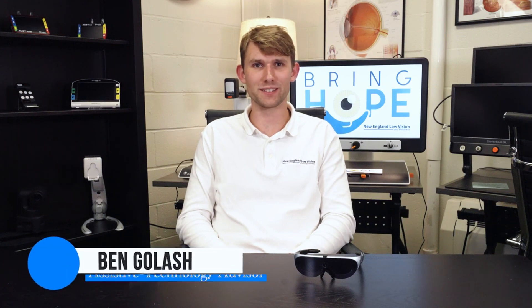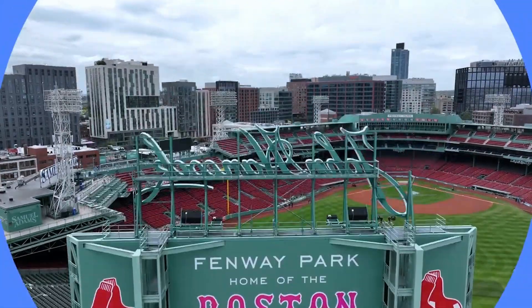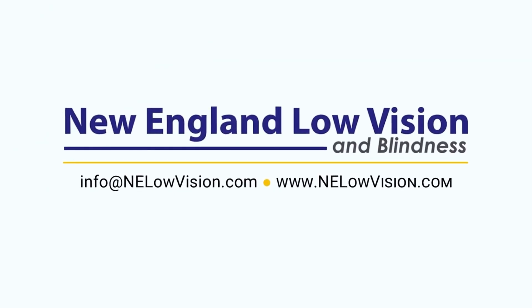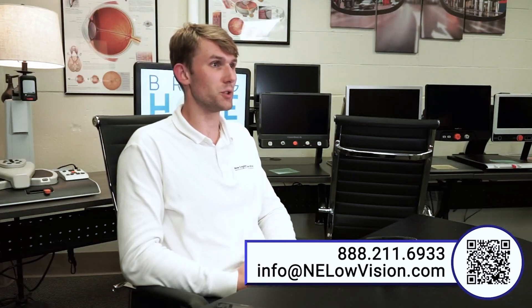Hello everyone, my name is Ben Golash with New England Low Vision and Blindness, and today we're going to be trying out the Idaptic i6. The Idaptic i6 has exactly the same hardware as the last version, which is the Idaptic i5, but it has new functionality using AI to be able to do text-to-speech as well as scene description.